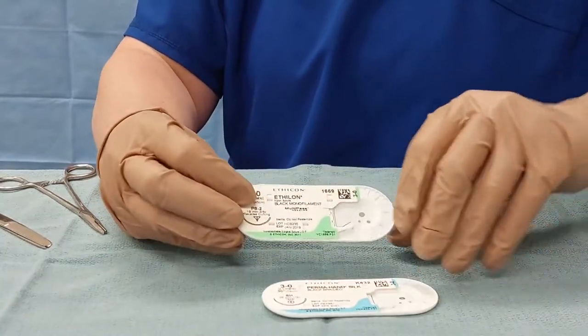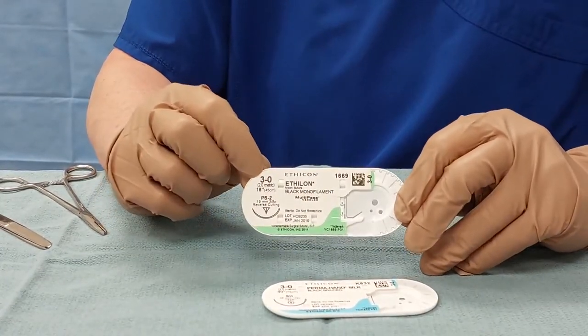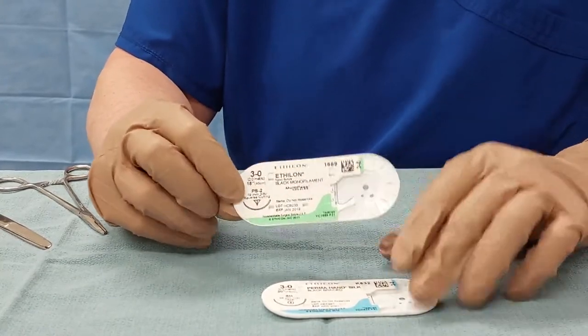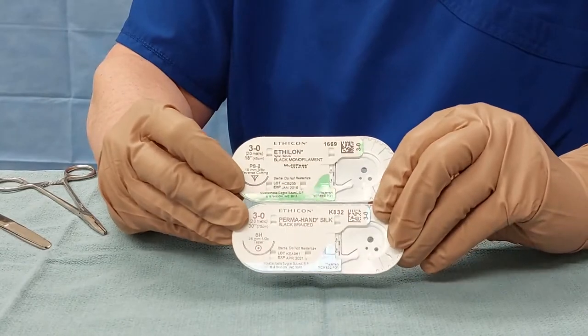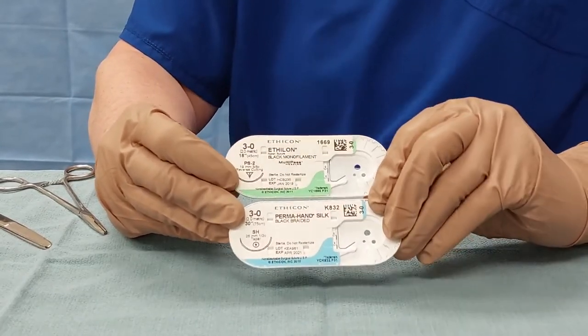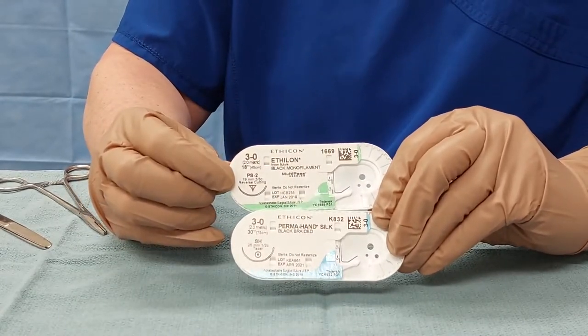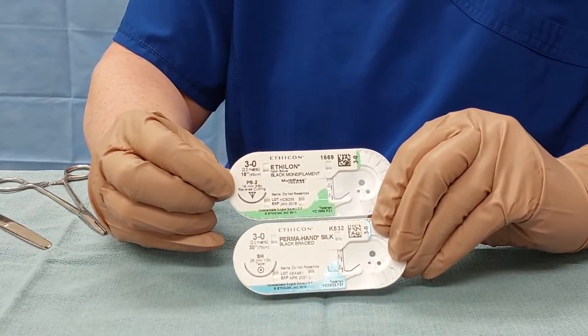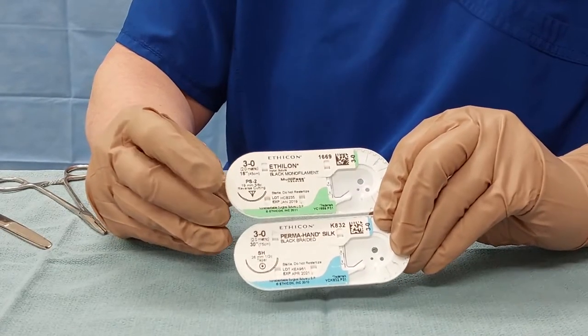Suture materials: you want a non-absorbable suture in a size 3.0. The sizing is at the top. Any non-absorbable material is acceptable, but strongly recommended is either a silk, ethylone, or proline. The size and shape of the needle is also a little bit of personal preference, but we recommend a curved needle and either a cutting or a tapered tip is acceptable.